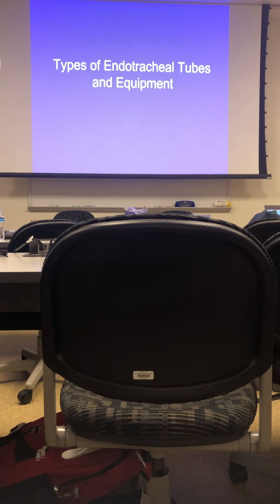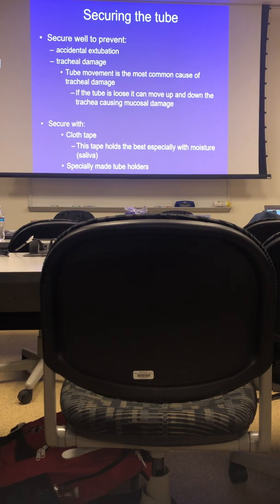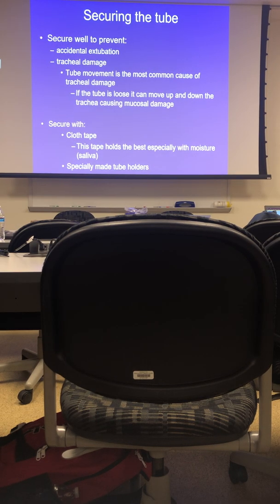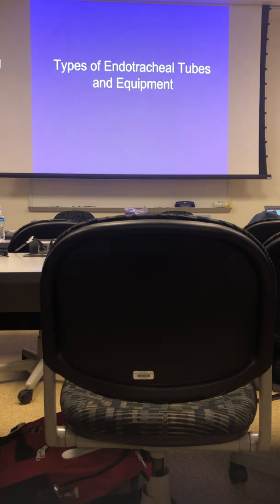Questions about intubating? The manometer? The cufflator, you mean? It's a cufflator. The cufflator is also called a manometer. It measures pressure. Okay. All right, and I'll look for one in a minute. I think we have one back there.